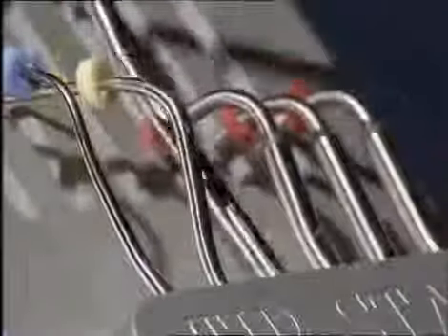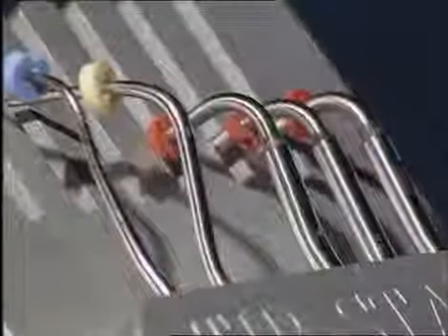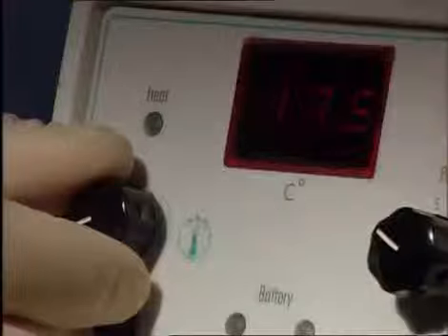With the help of the so-called Buchanan plugger, the gutta-percha is simultaneously heated and condensed. The largest plugger is selected, which can be fitted to within 5 to 7 millimeters of the canal terminus without binding on unyielding dentinal walls, and the stop is adjusted. The System B heat source is placed in the touch mode, set to 200 degrees Celsius, and used at full power on grade 10.